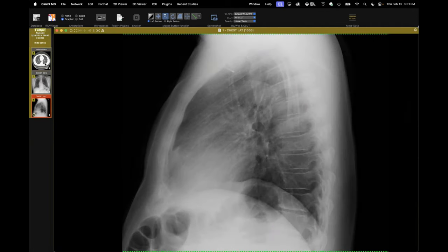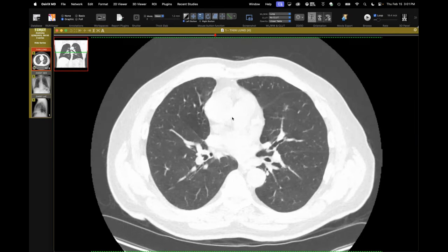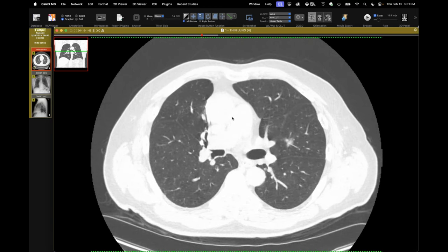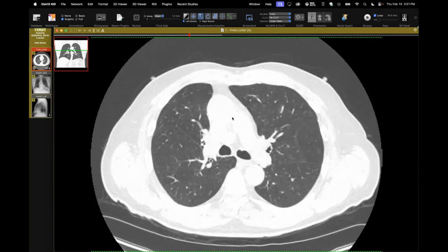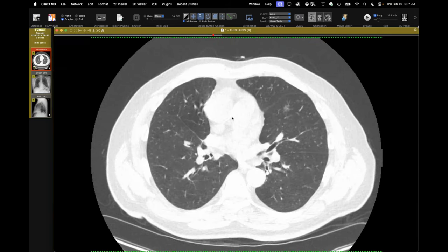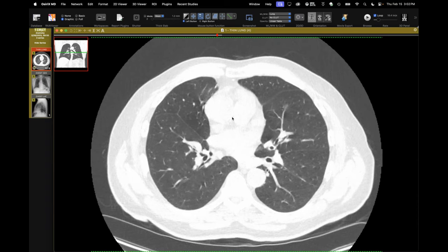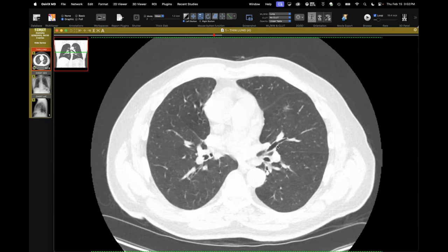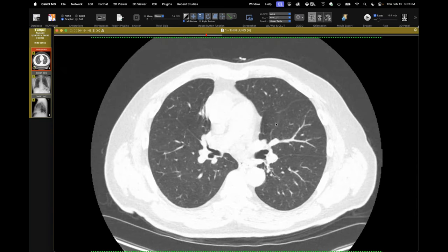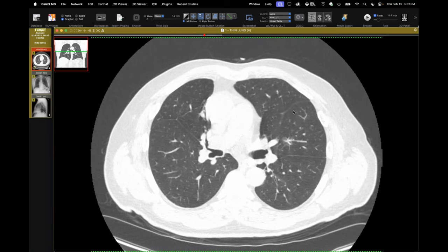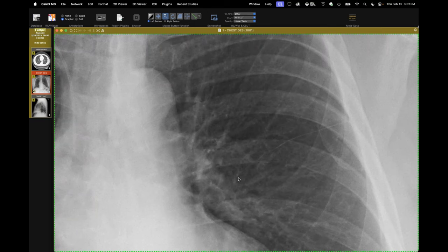The bronchi are normal on that side — upper and lower bronchus. There's the conventional arrangement: apical posterior, anterior, and the lingula. It's not really a middle lobe because it has a lingular bronchial arrangement, not a middle lobe arrangement — the segments are rotated 90 degrees, so you have superior and inferior lingular segments. It's a lingula, not a middle lobe. I've been waiting to see this and I see this fissure a lot on CT but usually incomplete, and I haven't seen it on a radiograph since I was a resident.